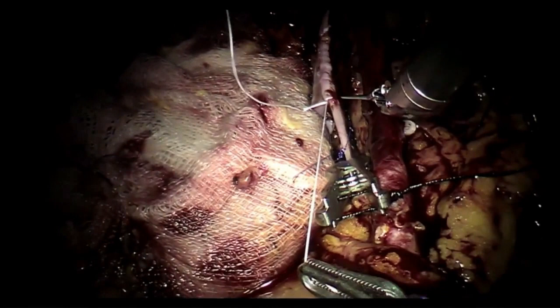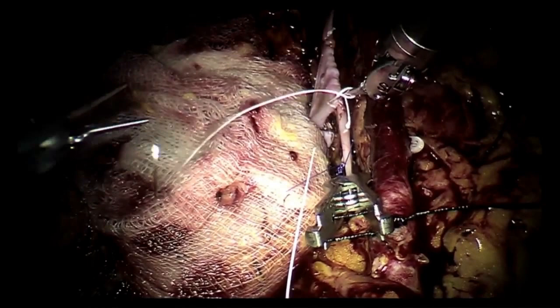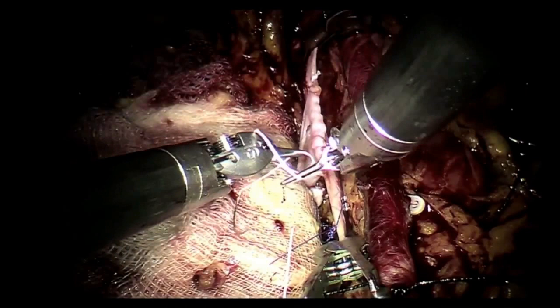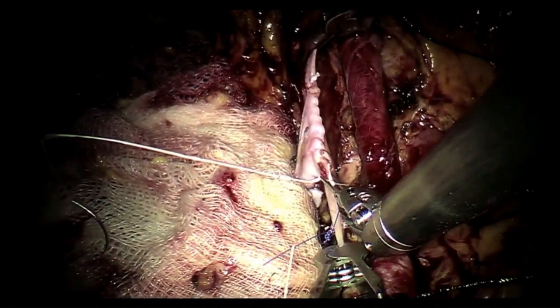Cut, please. No, not this one. This one, yeah. Perfect. Okay, get the other bulldog in now. Yeah, take out the needle. Hang on 1 second. Okay, agreed. Okay, go ahead.